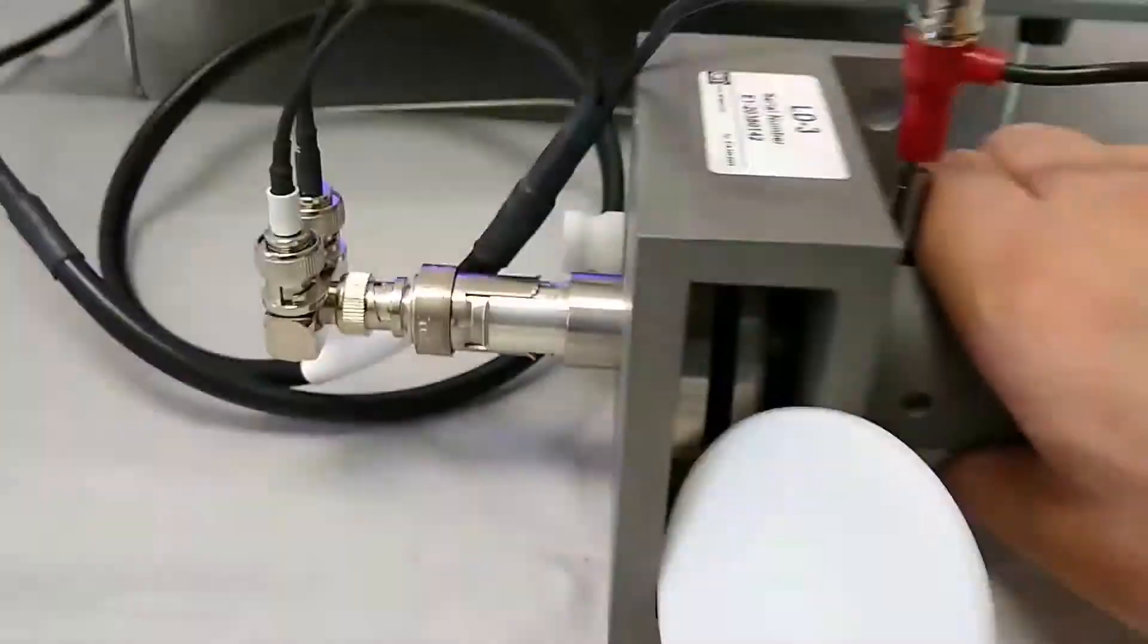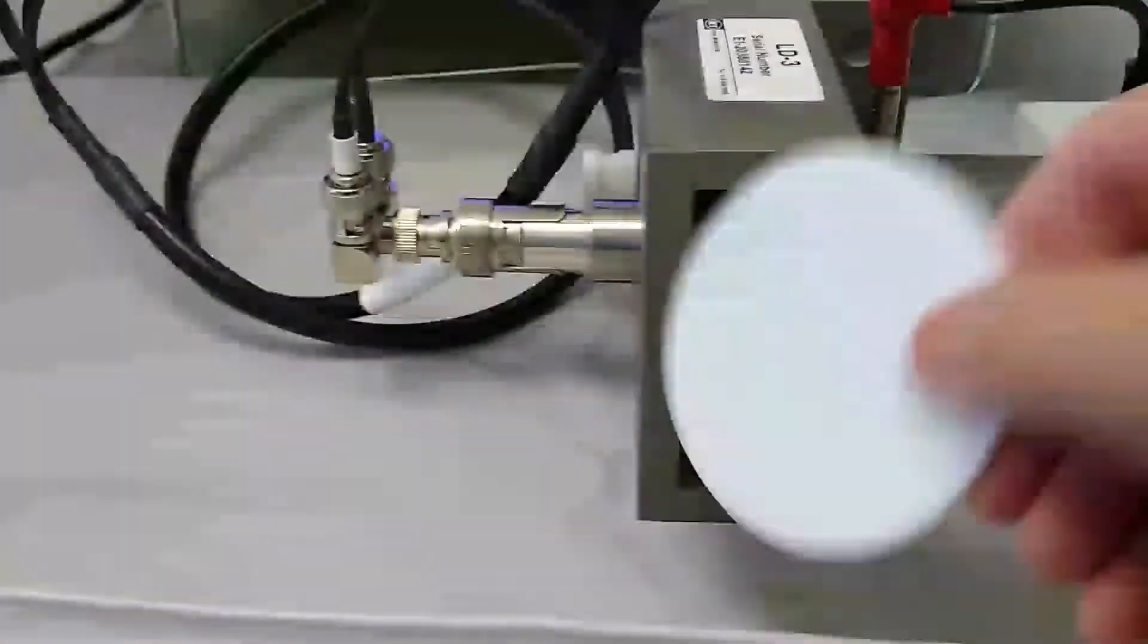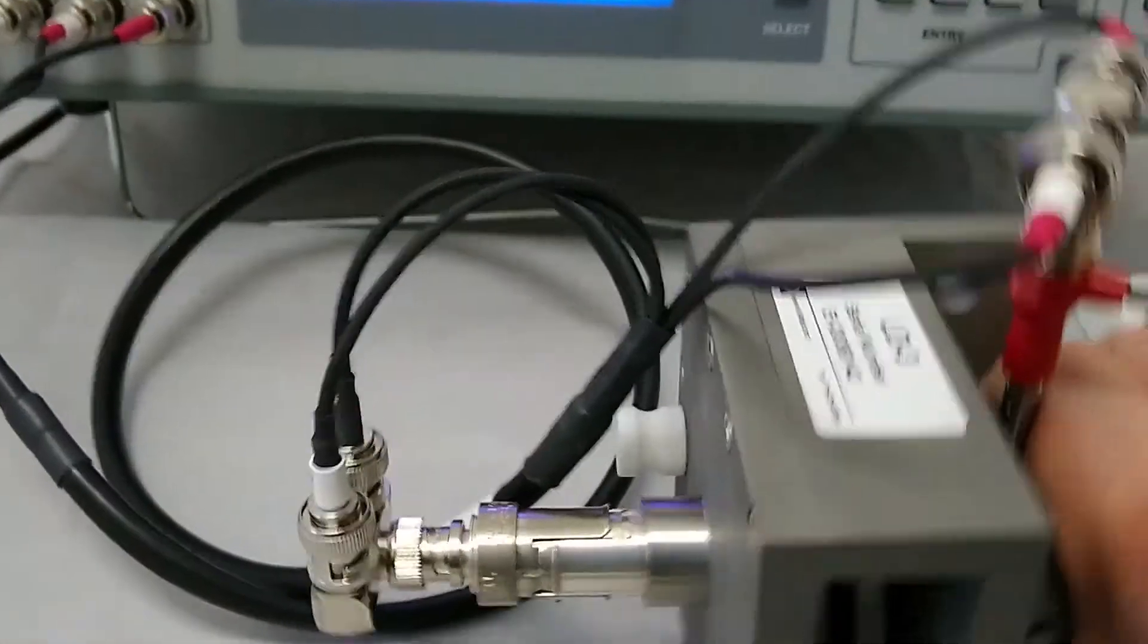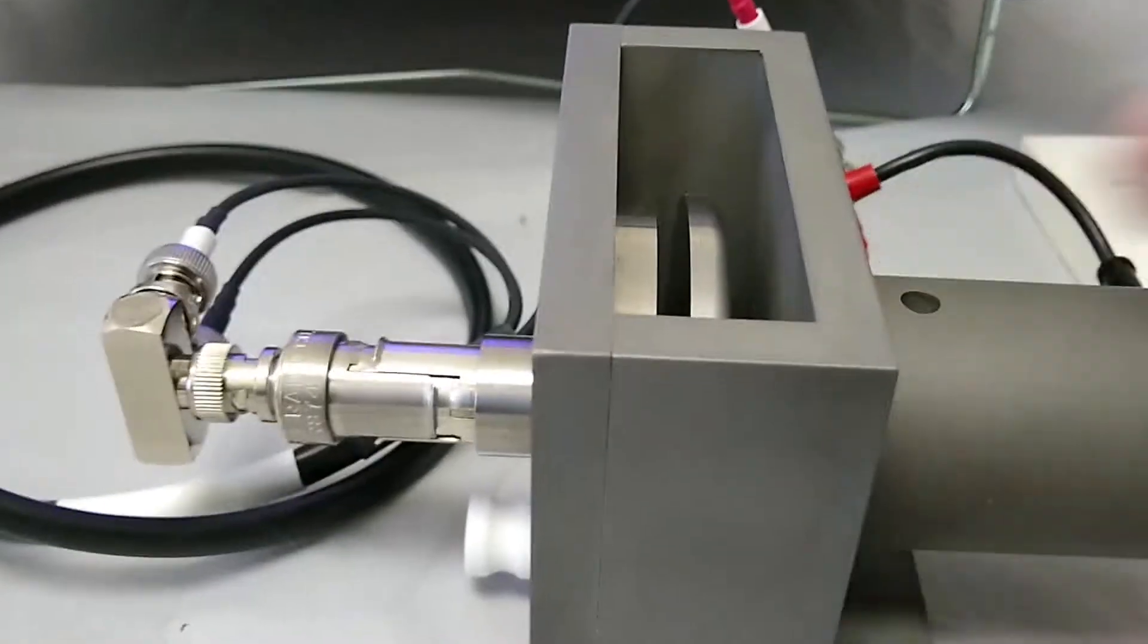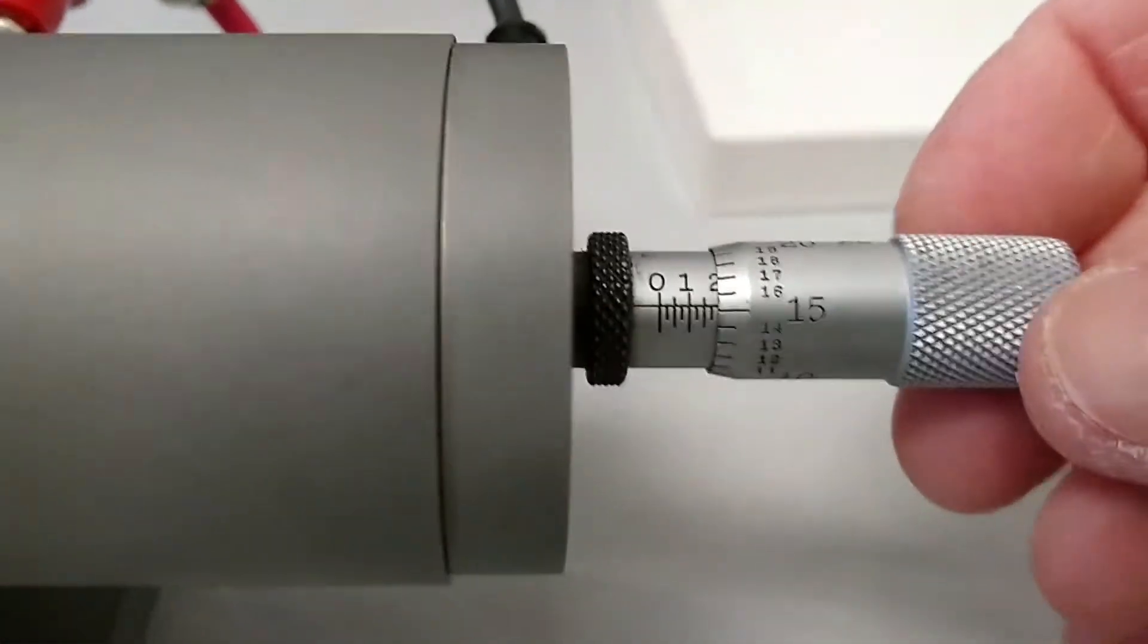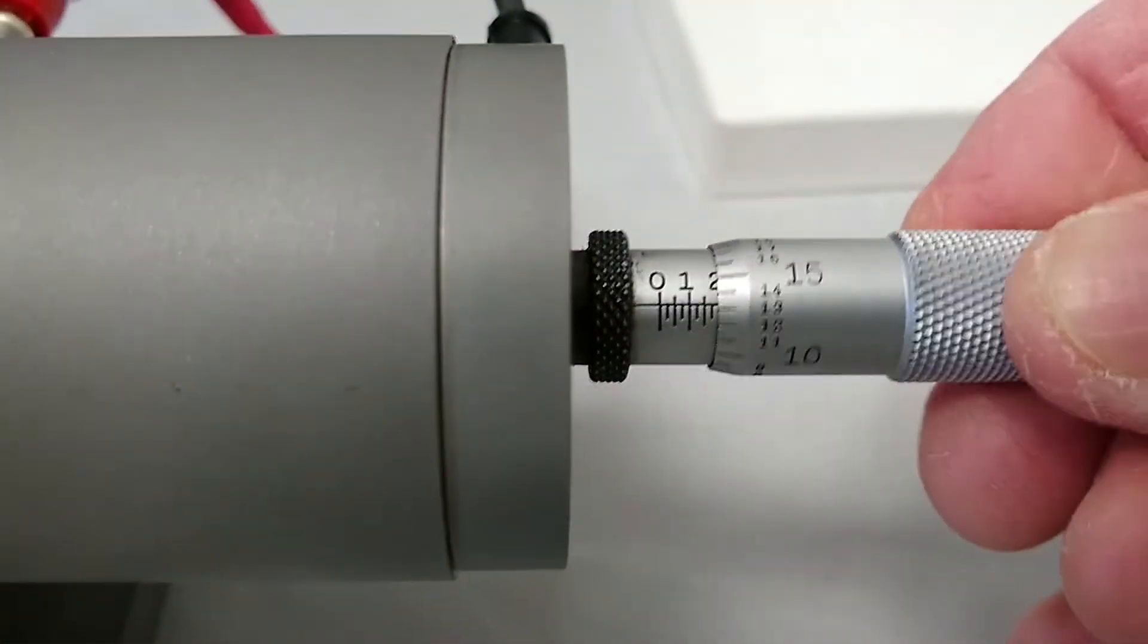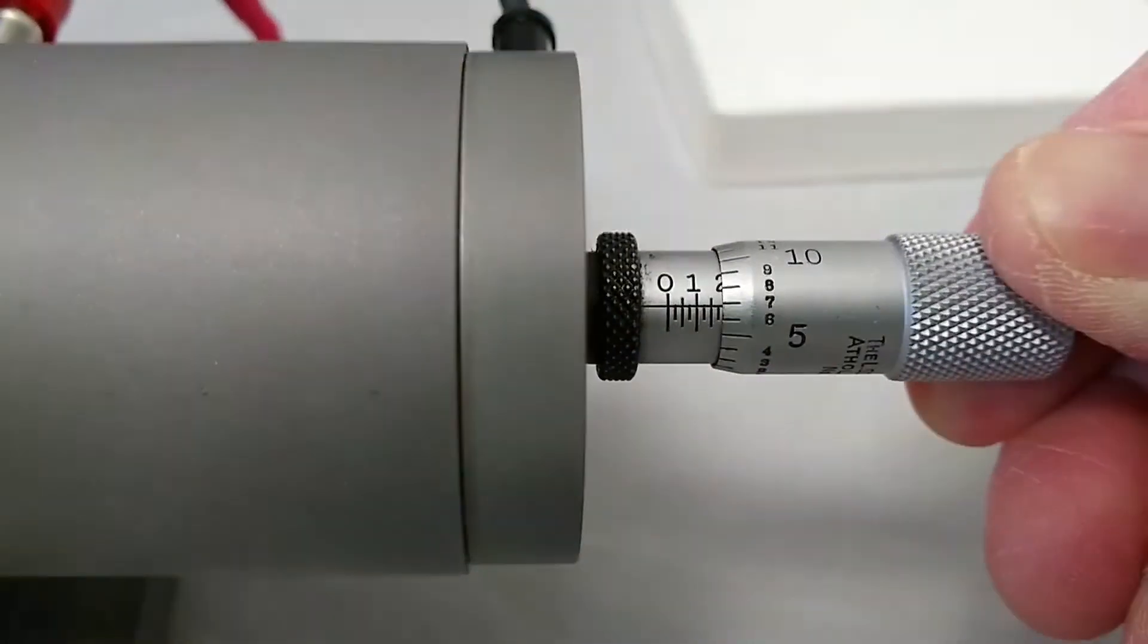At this point, we should be able to dump the Teflon standard out of the cell. Manage to do that nicely. Turn it back over.